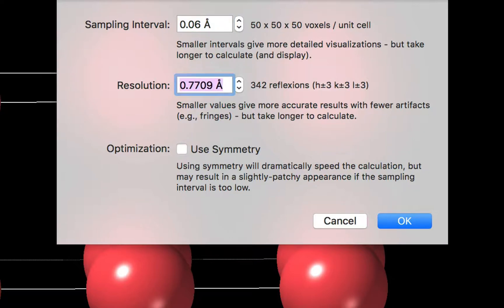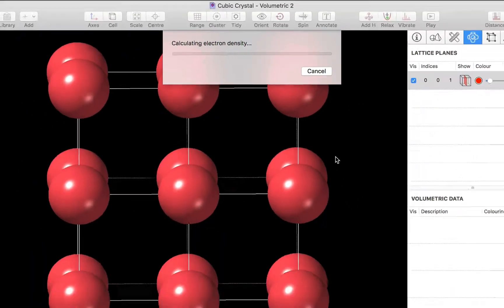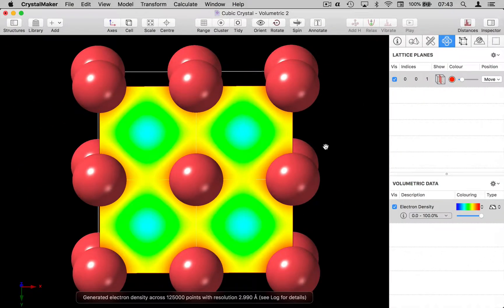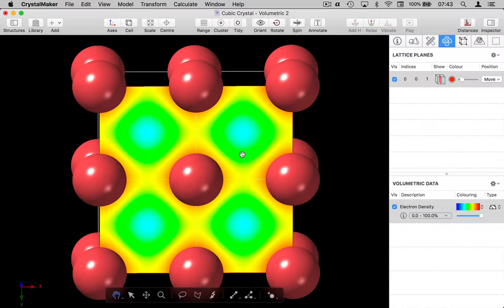For the sake of illustration I'm going to enter a very low resolution here. I click the OK button and we get an electron density map which initially is displayed as a lattice plane section.